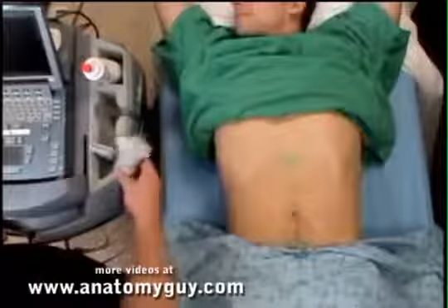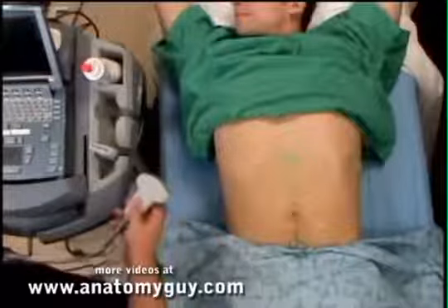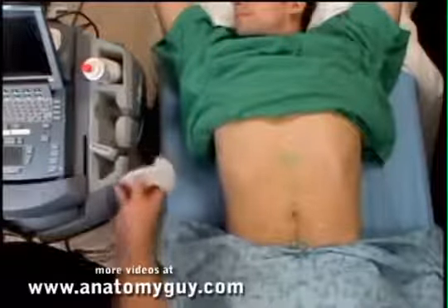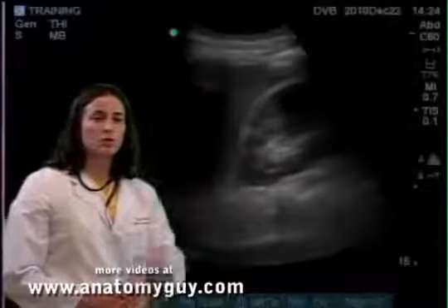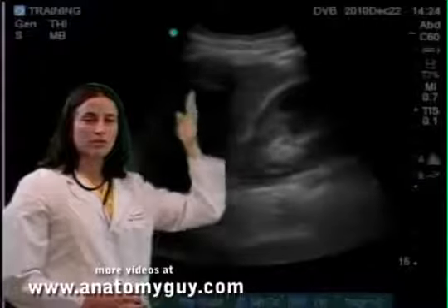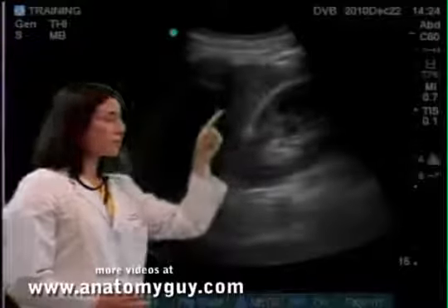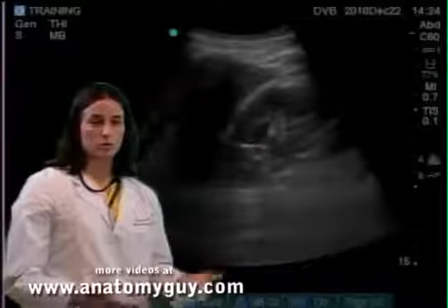For the FAST exam, the first area that we want to look at is at Morrison's pouch. The probe marker is placed towards the patient's head at the lateral costal margin, more inferiorly, to get a better look of the liver, which we will look at now. The probe marker position towards the head is actually indicated by this dot here on our screen. So we have here liver behind me and then kidney. There is no black hypoechoic stripe between the liver and kidney along this line, indicating that there's no fluid present.